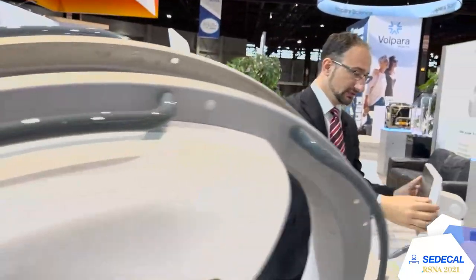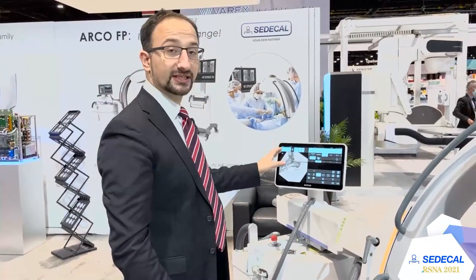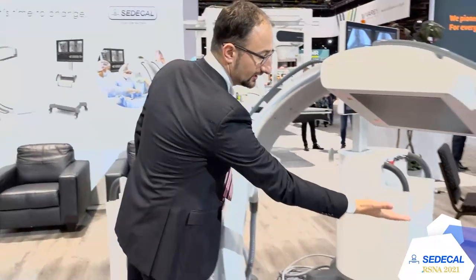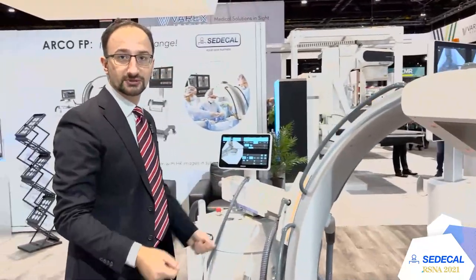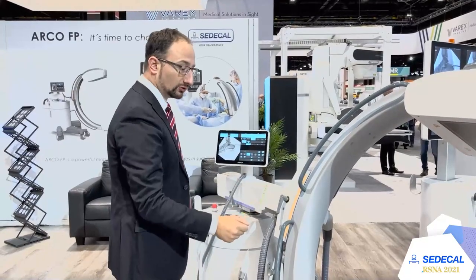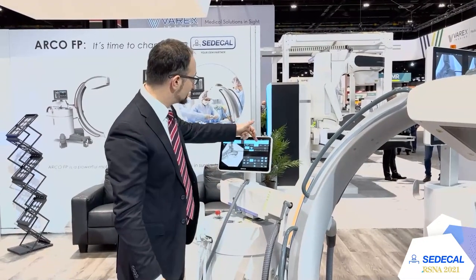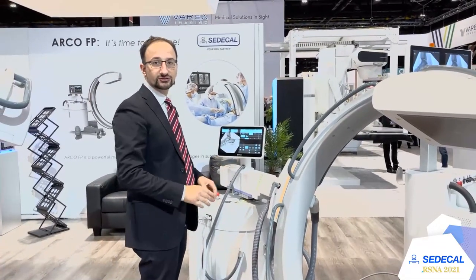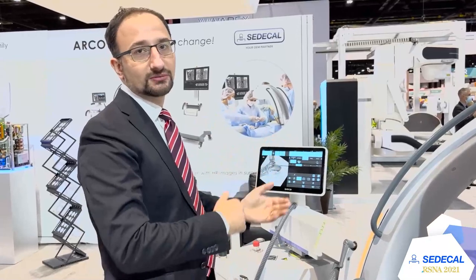On the control panel it's possible to set many things. The operator can always see the image in real time together with the doctor, making it easy to center. We have lasers for easy centration on the patient, which helps reduce dose because you can center using the lights. You can also program the laser timer as preferred. Here we have the list of anatomical body parts available, and you can personalize everything — enabling or disabling the anatomical parts the doctor needs.